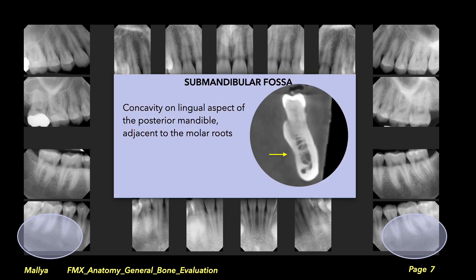Similarly, the submandibular fossa is a bony concavity located in the posterior mandible. This region projects as a radiolucency apical to the mandibular molar roots. Due to its extent and often marked appearance, it may be mistaken for pathology.